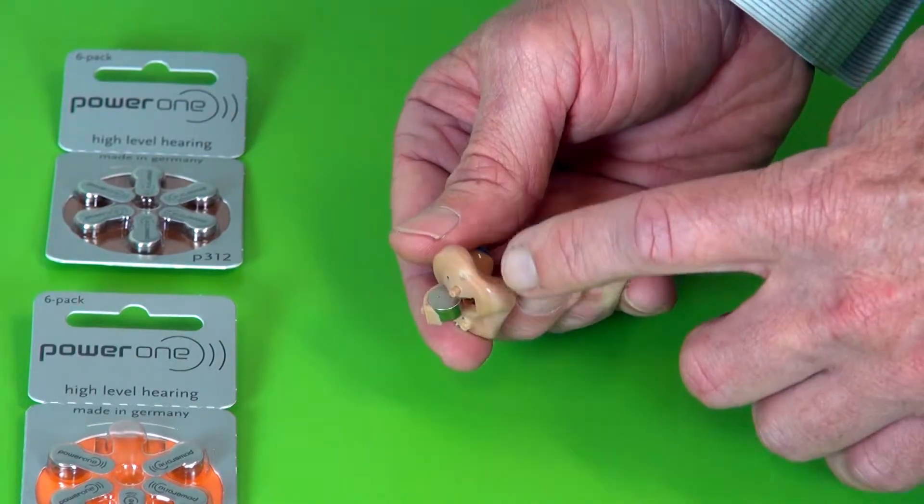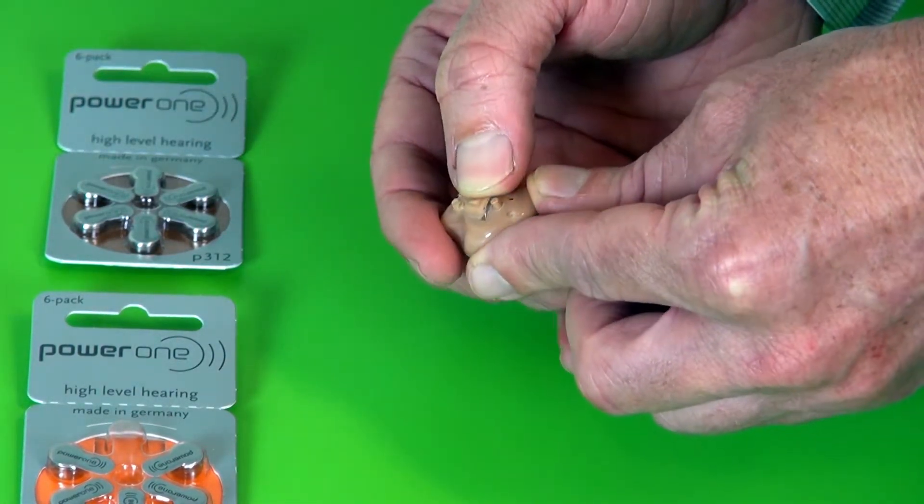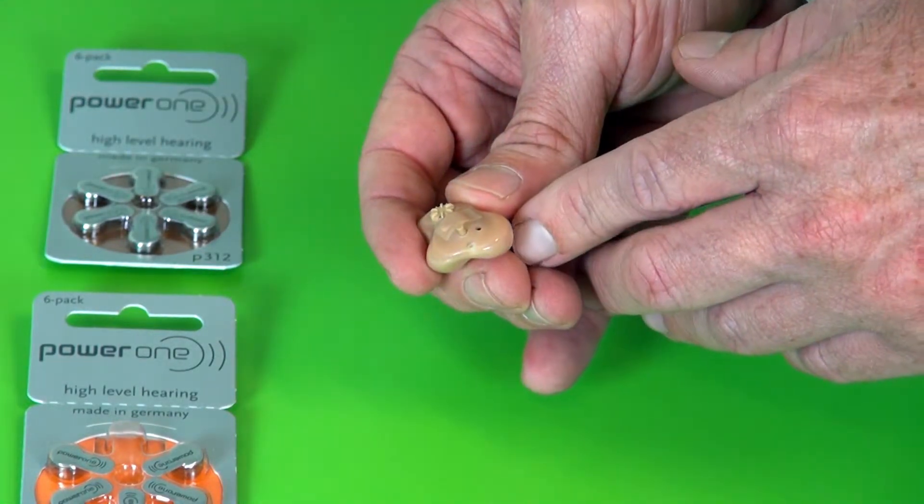So you can see now the hearing aid battery is sitting flush with the battery door. Then it will close nice and easily without any force. That will turn the hearing aid on.